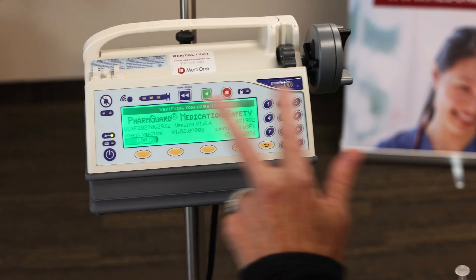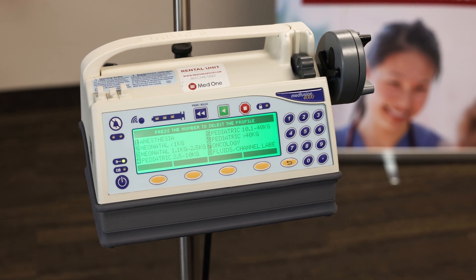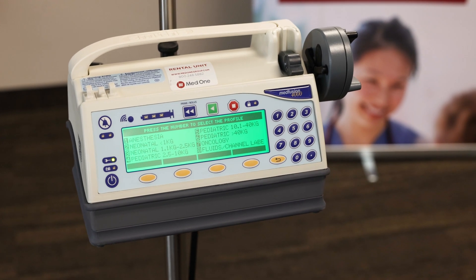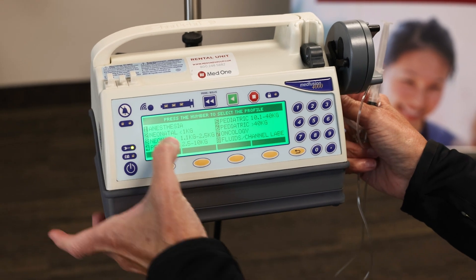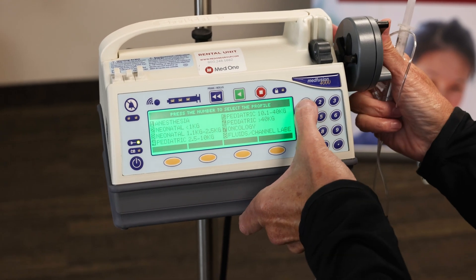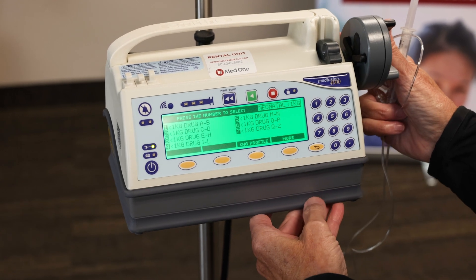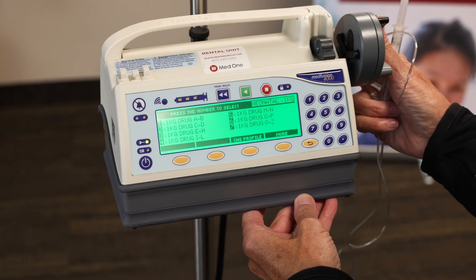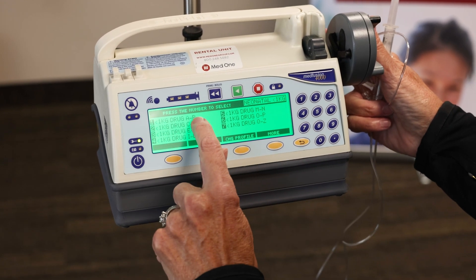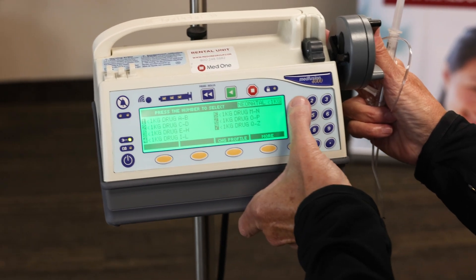Once it's finished with its power-up sequence, now we're at our care areas or profiles. I'm going to be using number two, the neonatal one or less kilos. I'll choose number two, then I'll press my drug — I'm looking for ampicillin. So A through B: remember these categories are right here so we can get to the alphabet quickly, so I'll hit one.